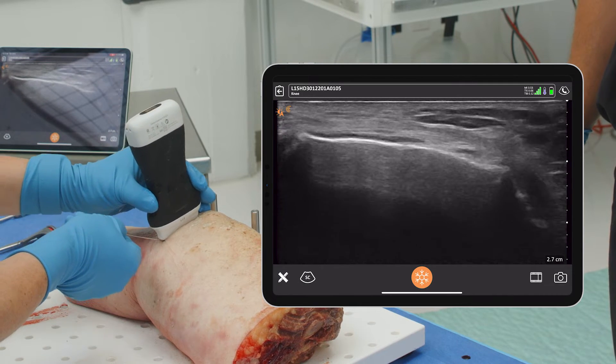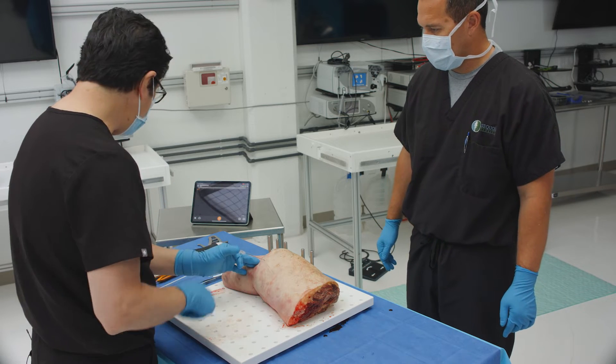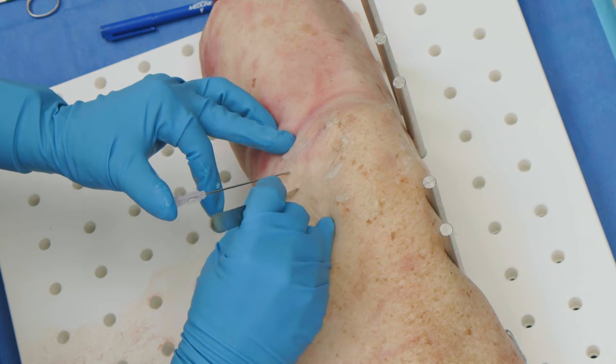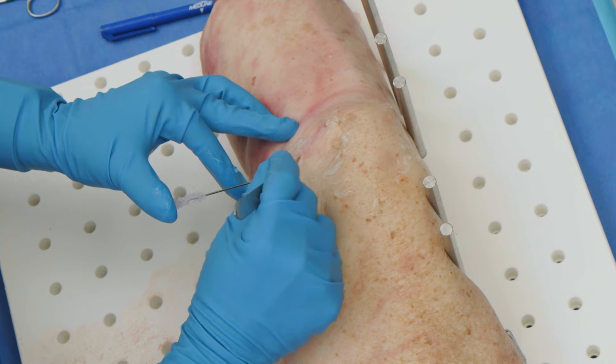Now that I'm in the perfect spot anatomically, I'm actually done with my ultrasound. I'm going to hold it there with my hand and make a small incision. I'm going to make this a little bit larger today so it's easier to see — normally I make a very small incision, it doesn't take very much.